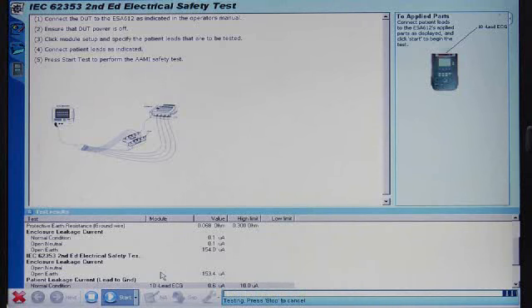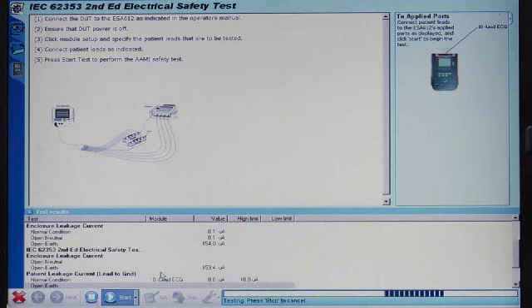of the medical device. As you can see, all of our measured values are reported step by step within the auto sequence, and we get an assessment of pass or fail along the way versus the testing limits that have previously been determined that come directly from the standards. Should any of these tests fail against the testing limits, it would turn the font red, so that we could identify that there was a failure.